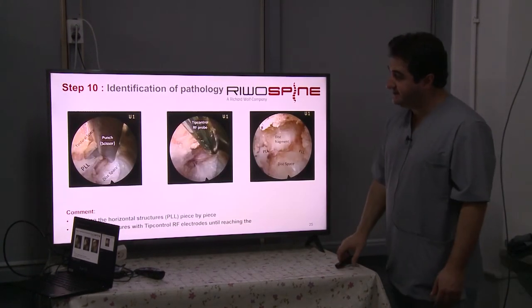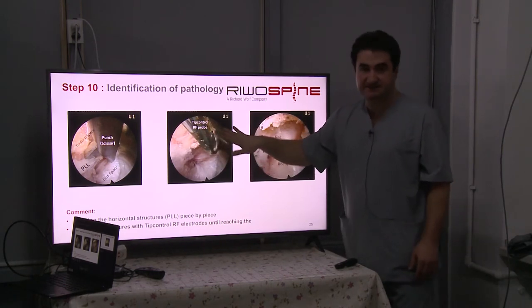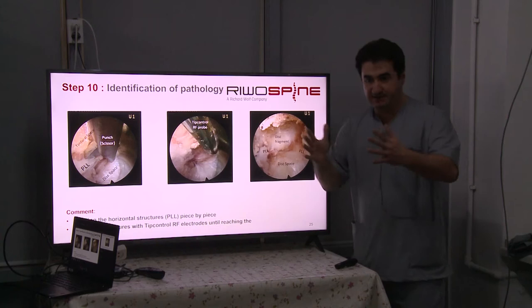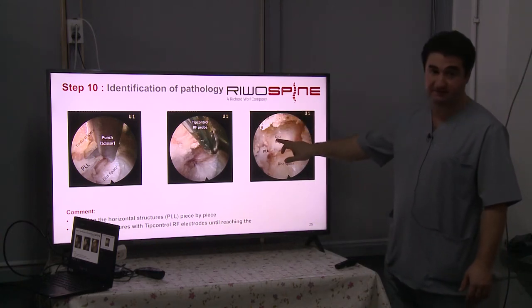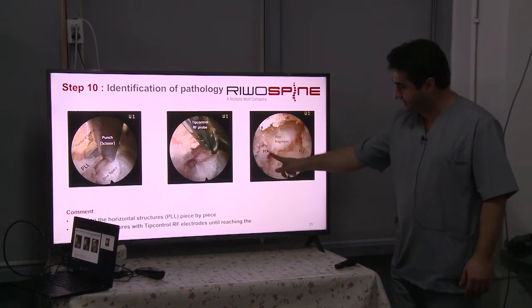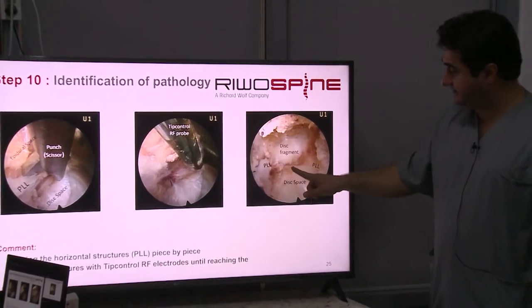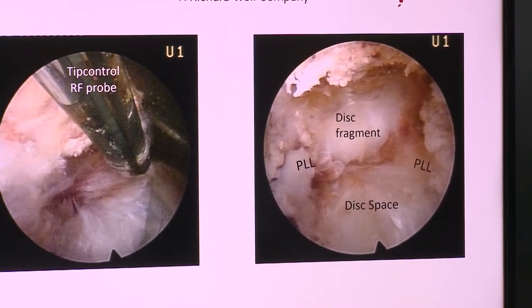Okay. And the next step, we cut one piece from the PLL and then shrink the PLL. Then we have more space into that. And then we find the fragment in front of us. Again, this space, PLL, posterior longitudinal ligament, and disc herniation here. You find the herniation in front of you.